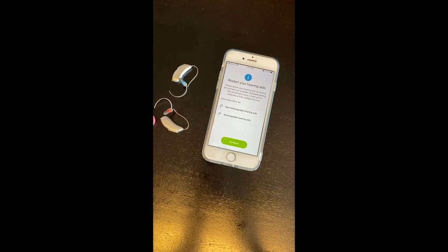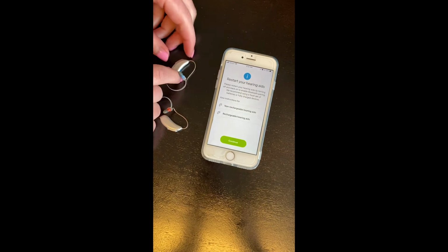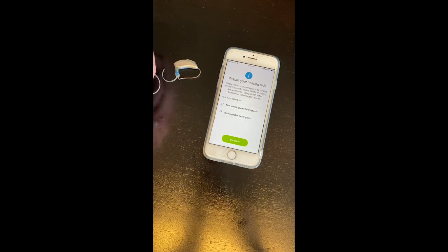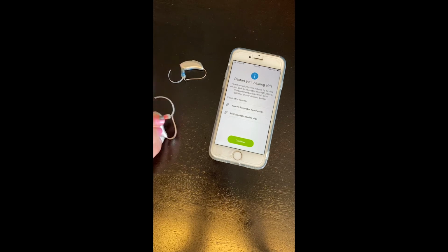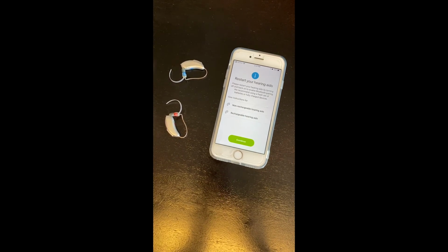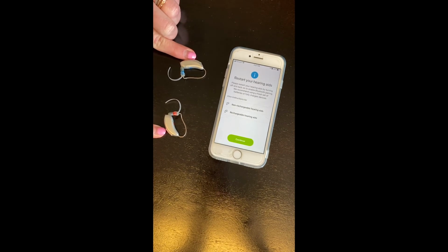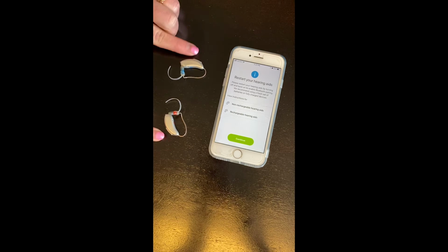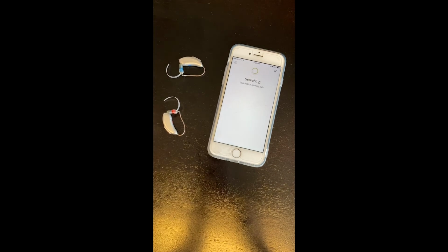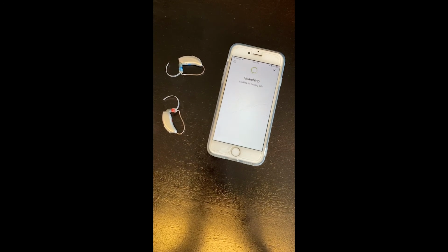These are non-rechargeable hearing aids, so for these ones we want to open and close the battery doors like that. If they were rechargeable hearing aids, we'd want to set them down in our case and then take them out, or turn them off by pressing these back buttons and holding down until the red light turns on, and then again until the green light turns on. Okay, we're going to press continue. And now it's searching for these hearing aids.